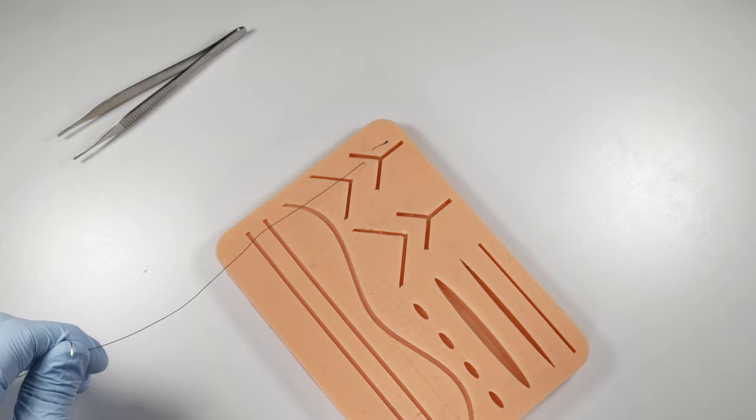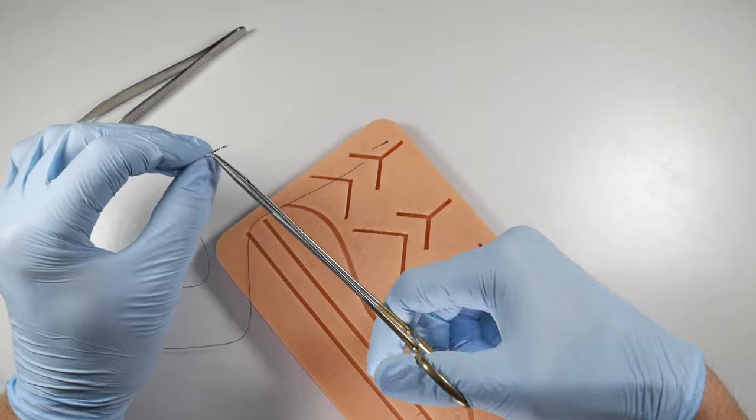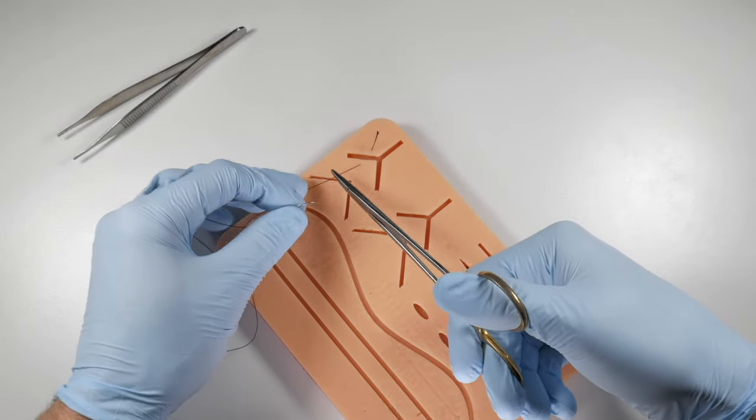Make sure that if you are suturing to stop a bleed that you have visualized well inside of that socket and that you keep an eye on that patient.